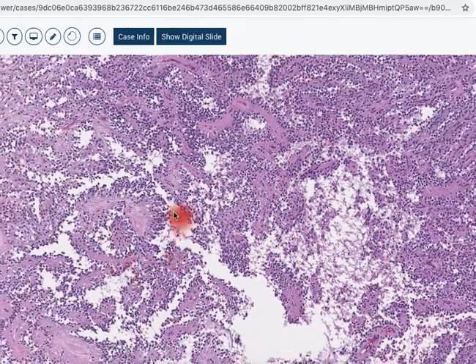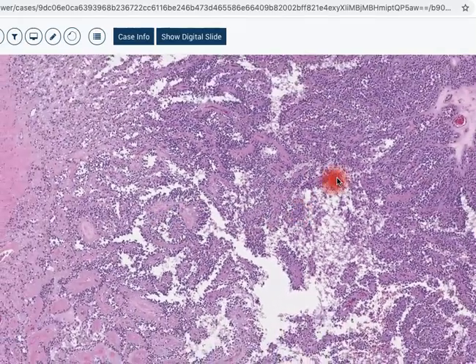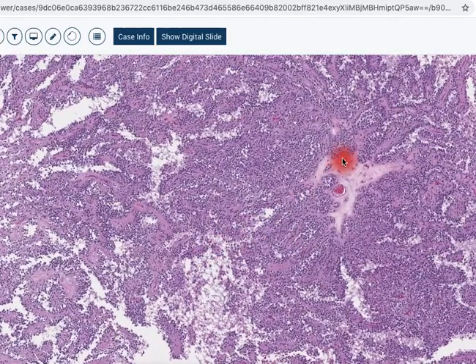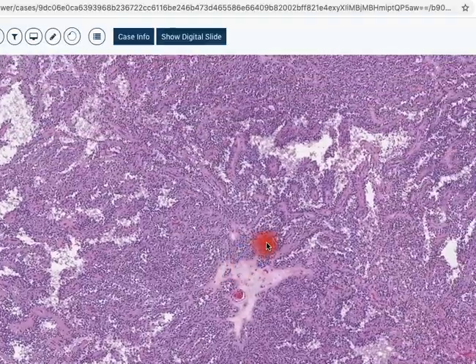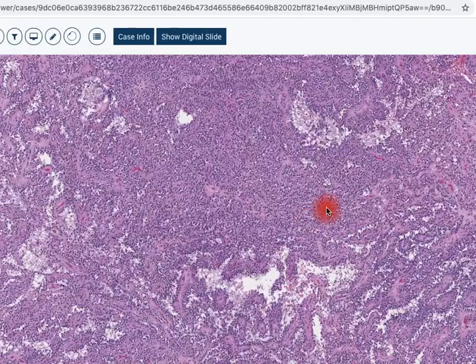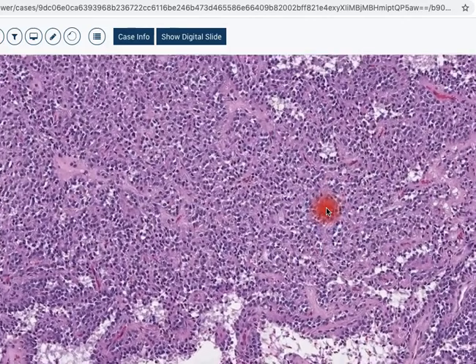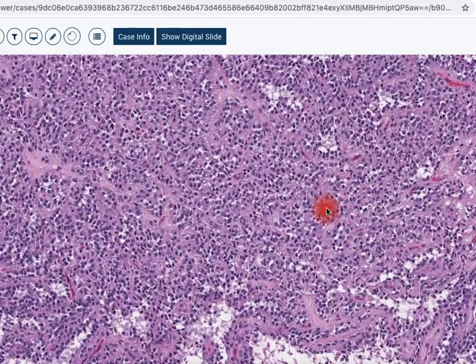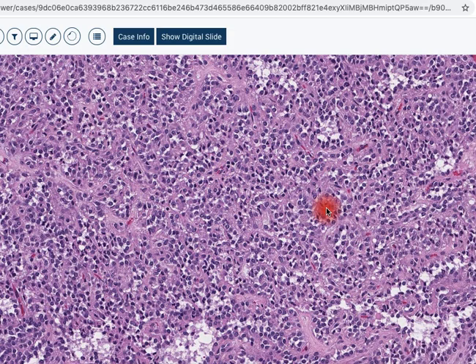Based on this type of architecture, especially with this papillary-like formation, one would be thinking very early on about a solid pseudopapillary tumor of the pancreas. The differential diagnosis for that, of course, can include neuroendocrine tumors as well as some acinar lesions. We want to consider those as we look into the differential, perhaps getting some immunoperoxidase. Although in general, immunoperoxidase is not particularly specific, and many of the commonly available stains do not reliably differentiate between neuroendocrine and solid pseudopapillary tumors.